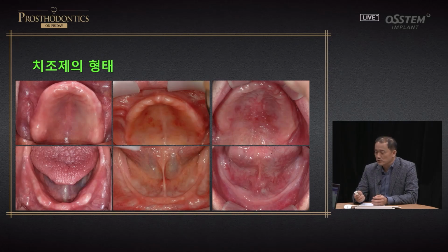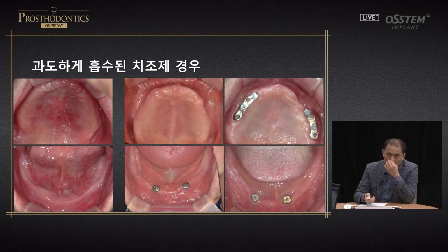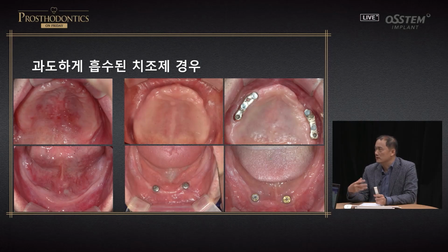Now, sometimes alveolar ridge is not good, but sometimes you have satisfactory level of retention. But this is, although the alveolar ridge is not good, there are some parts where you can at least secure minimum level retention and stability. That's the reason. So if there is this type of alveolar ridge resorption and you cannot really have good retention or stability, after delivering full denture, it stays on. But after mastication, with the functional pressure being loaded, it cannot be retained, and full denture you probably have experienced come off.